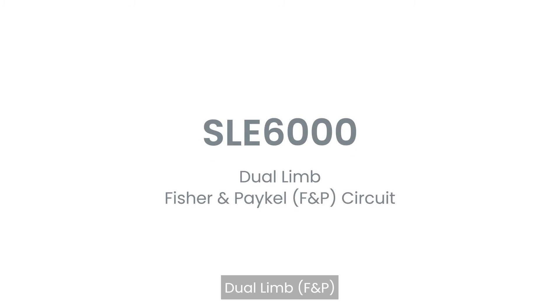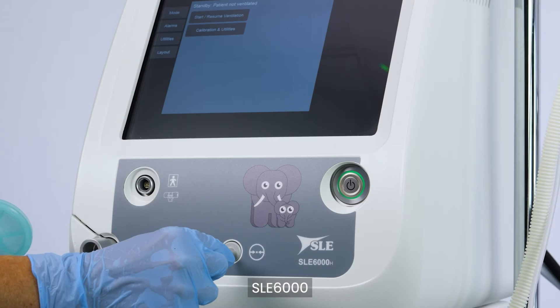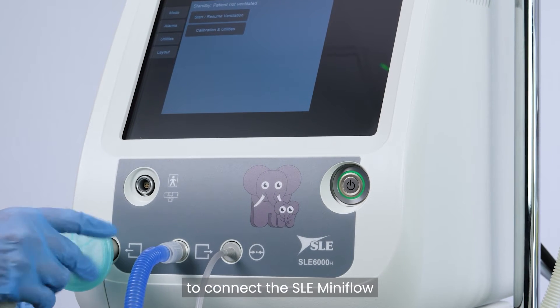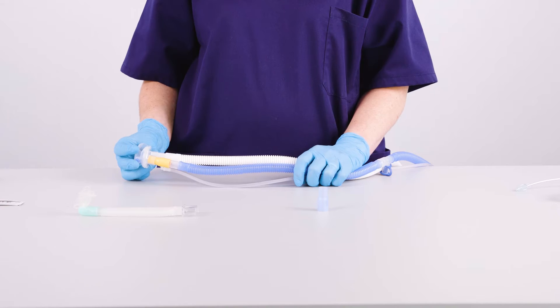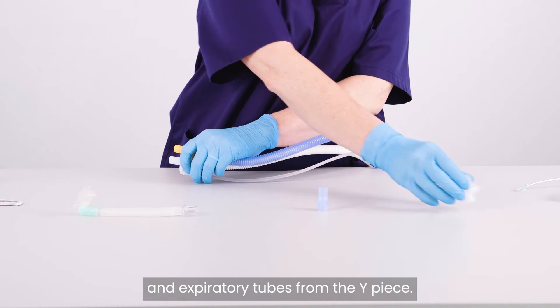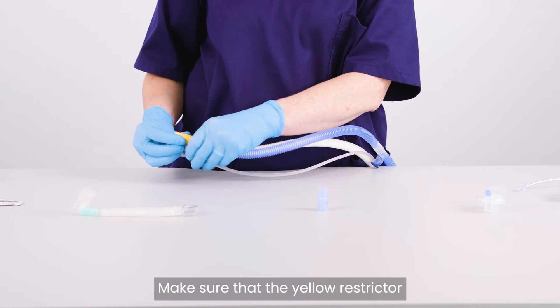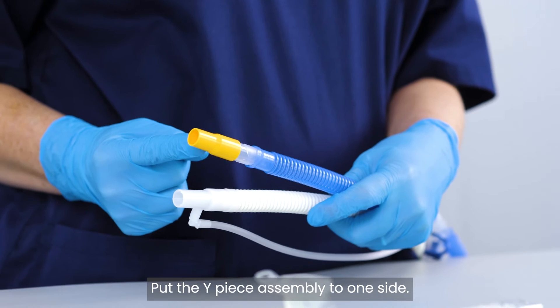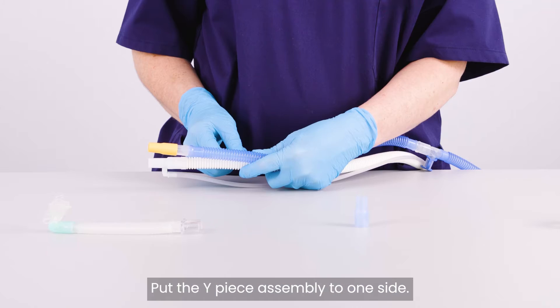For dual-limb F&P setup, connect a Fischer and Paycal SLE-6000 patient circuit to the ventilator. To connect the SLE mini-flow to the patient circuit, detach the inspiratory and expiratory tubes from the Y-piece. Make sure that the yellow restrictor is still connected to the end of the inspiratory limb. Put the Y-piece assembly to one side.